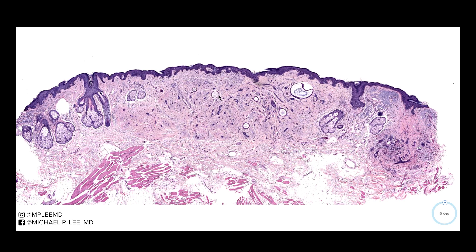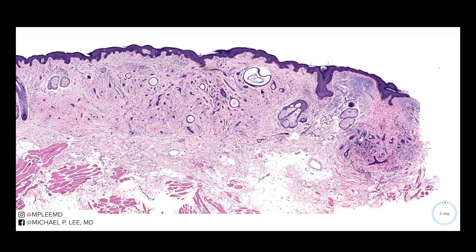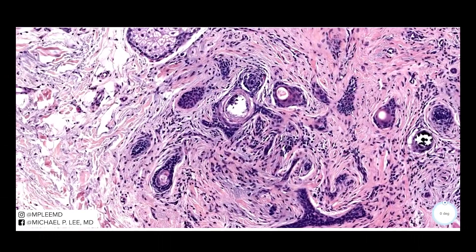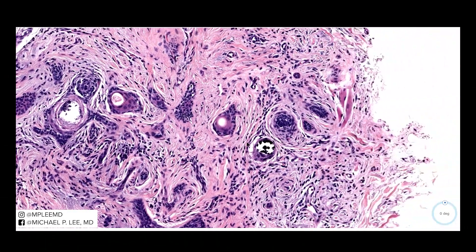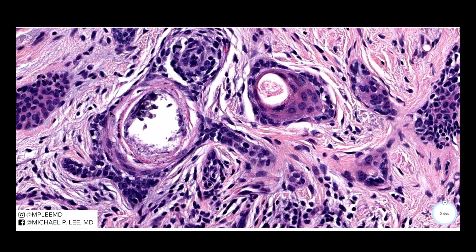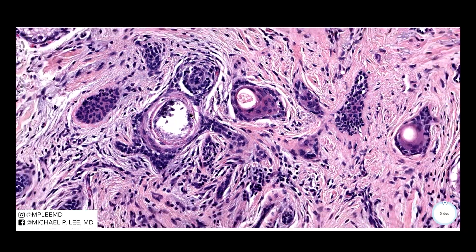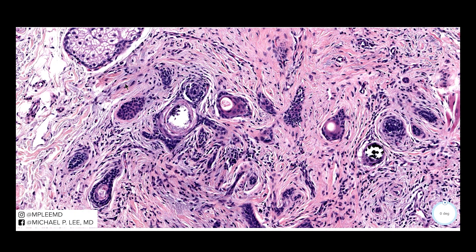We do see numerous horn cysts here with keratinaceous material in there. Anytime you have cysts in the skin, they often rupture — sometimes by trauma, sometimes on their own — and the repair process can occasionally lead to calcifications developing within them. This is a helpful diagnostic clue: basal cell carcinomas are less likely to have calcifications, while desmoplastic trichoepitheliomas will more commonly have calcifications, probably due to the presence of the cysts.